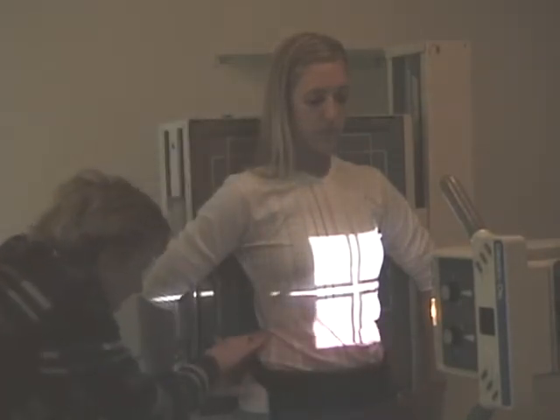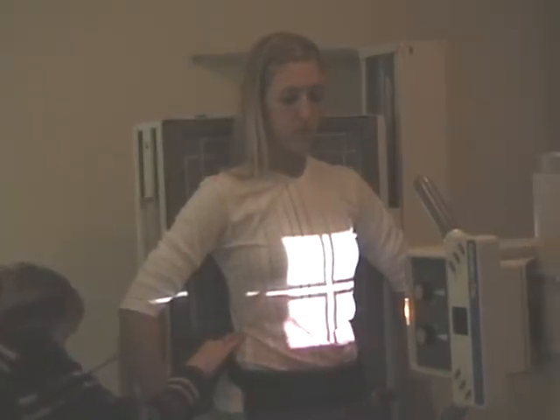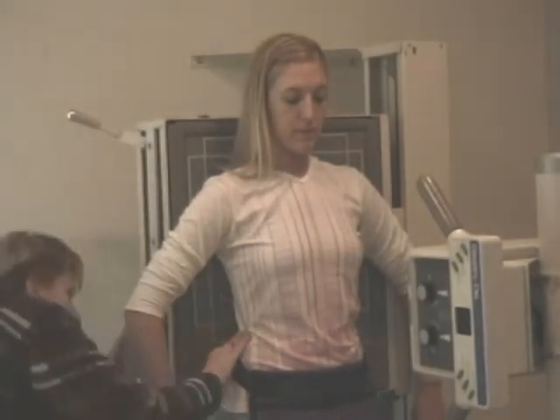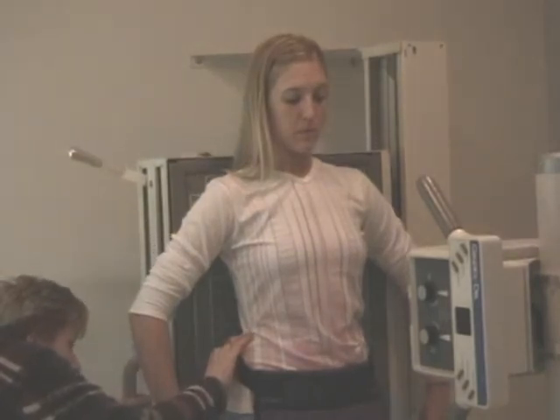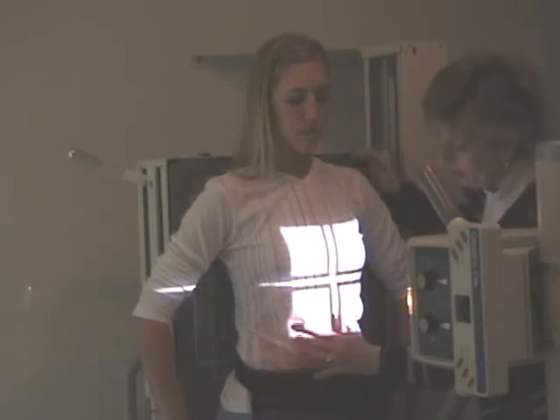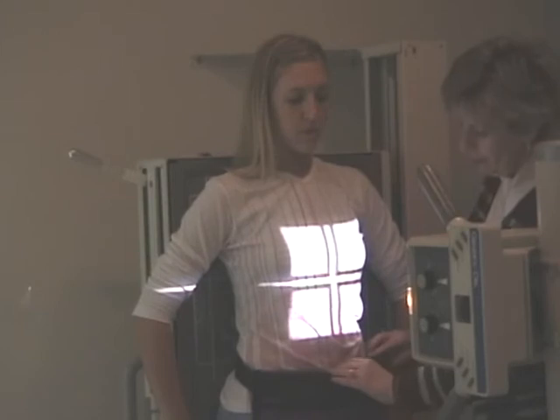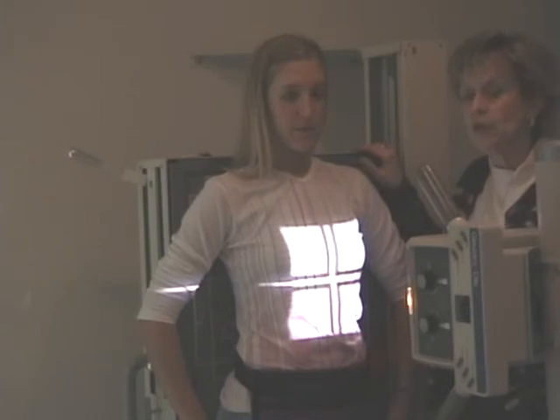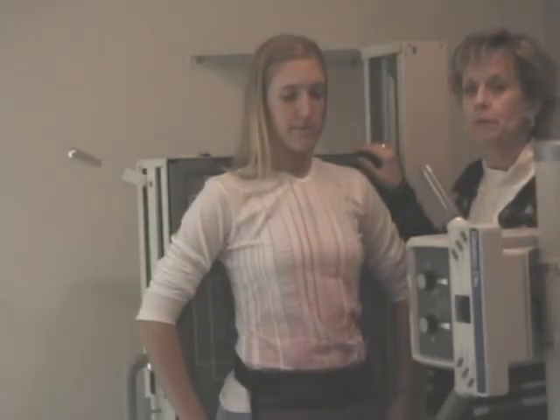Her hips should be at the same height, so I'm just going to use her iliac crest here, film's edge 1 inch below. And then step over here and look at the amount of light on the table. And then how would you breathe the patient? The shielding is below her ribs. I wanted to make sure that. How would you breathe the patient for below diaphragm ribs? You want the diaphragm to elevate. You want to have the patient blow their breath out. Do not breathe or do not move.